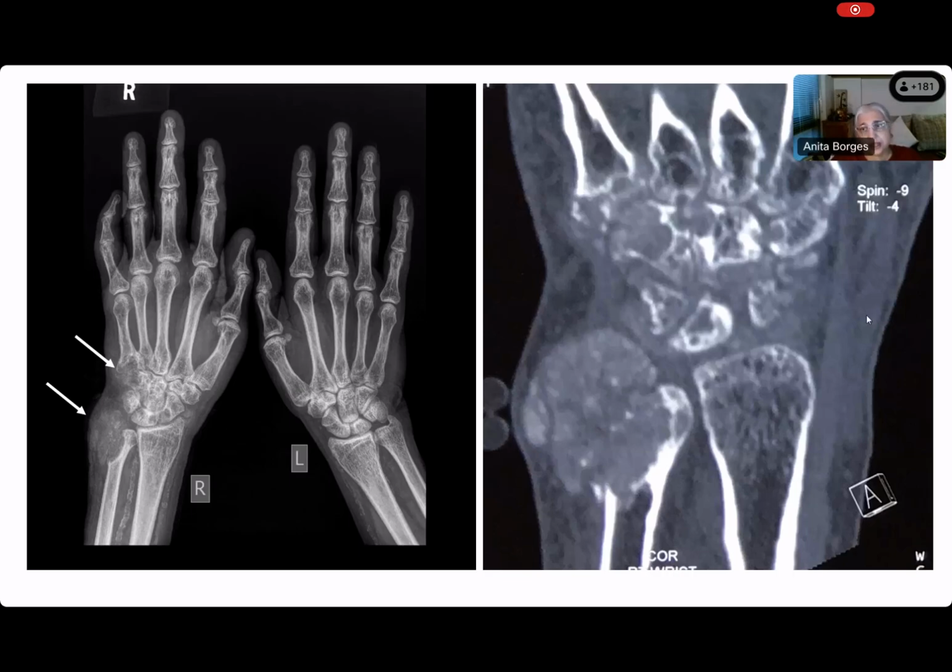Okay, anybody in the chat box had answered the question? Loma or Vatsala? Yes, ma'am. One has mentioned both cortex is white, so CT, and another person has mentioned MRI, and someone has written CT. You know that the cortex can be white or black depending on whether it is T1 or T2, no? So that's always an issue when you come to MR. That's neither here nor there.